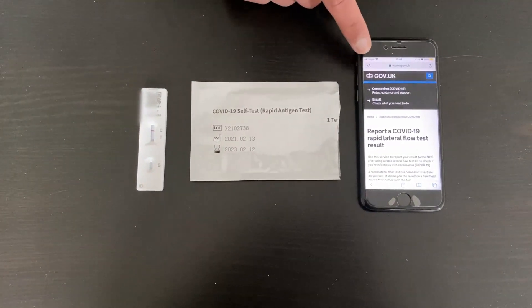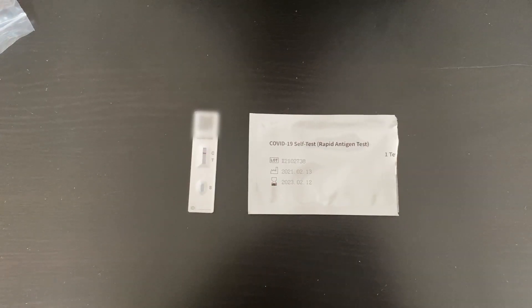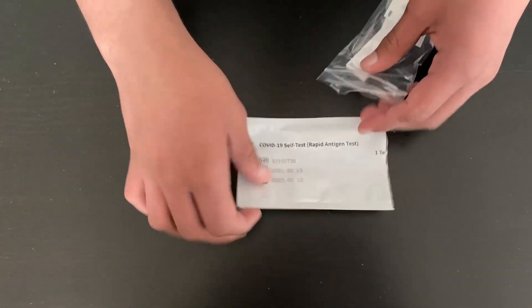Once you have your results, you should go to the gov.uk website in order to report your result. Once your test is completed, you should get your waste plastic bag and put everything in there so that you can safely put it in the bin.